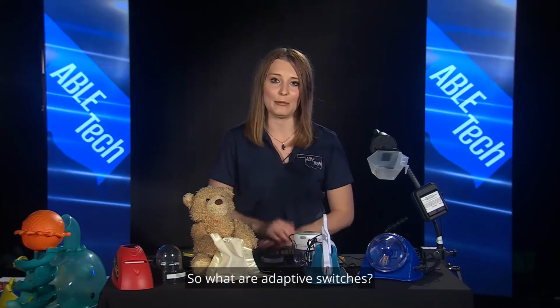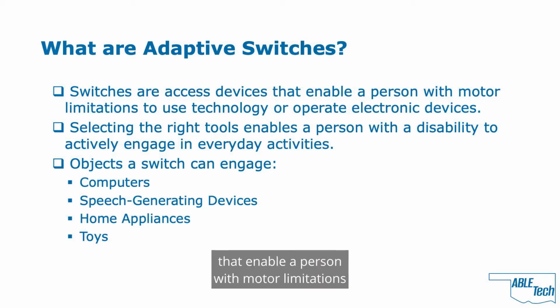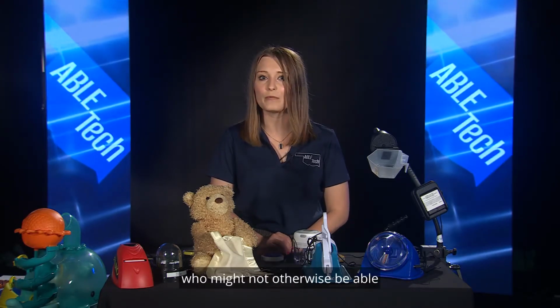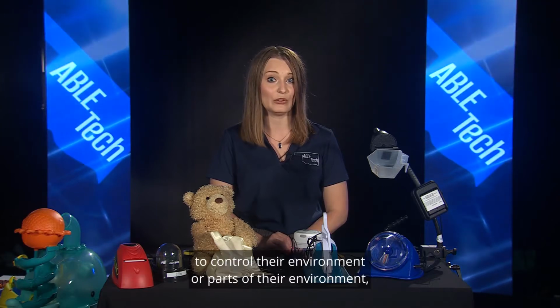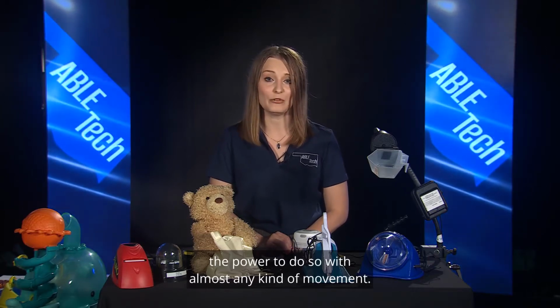So what are adaptive switches? Switches are access devices that enable a person with motor limitations to use technology or operate electronic devices. The simple movements used to operate a switch replace complex actions that limit independent access. When we break it down, switches allow individuals who might not otherwise be able to control their environment or parts of their environment the power to do so with almost any kind of movement.